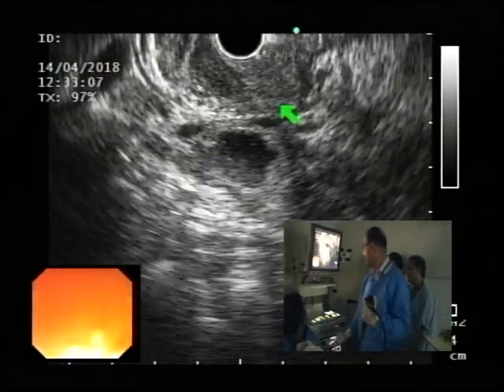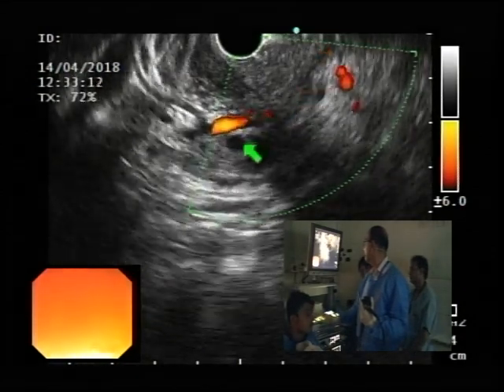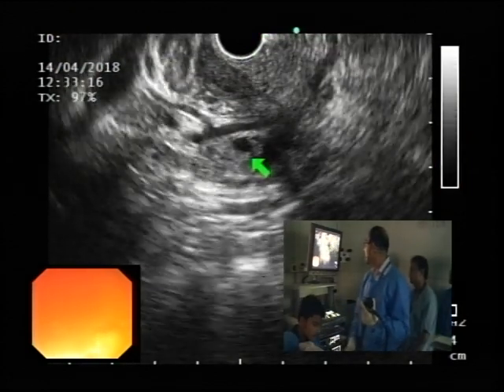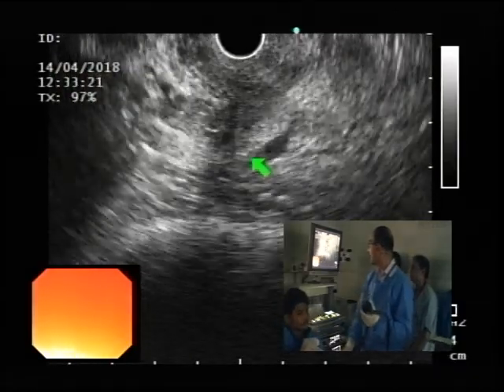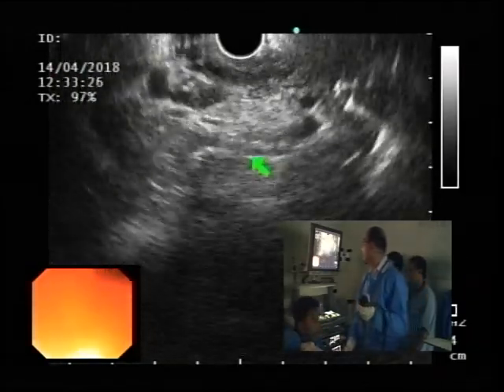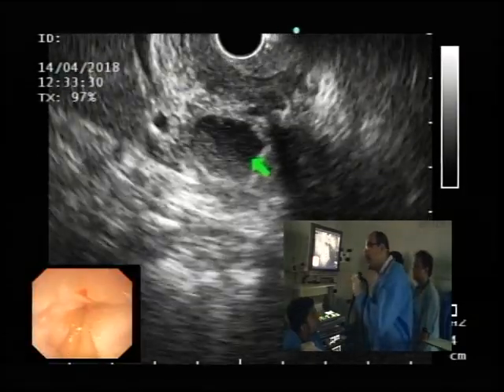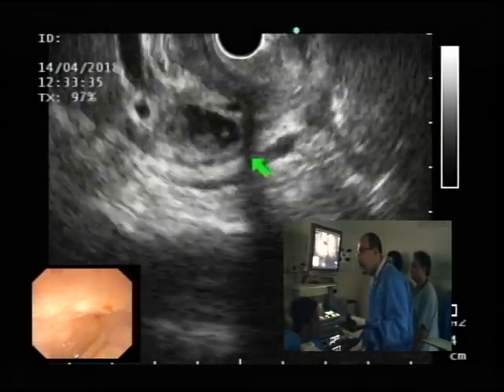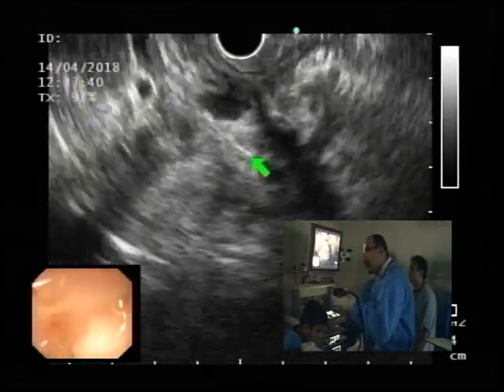So we have, I believe, come upon the pancreatic duct here. This one here going down, because that was the dilated duct. So now if I keep that in view and go counter, then I might be able to find the bile duct. In him, I'm not confidently being able to see the bile duct, so I'm going to move on now. I may have had it in view and not recognized it, but either way, it doesn't change the fact that I haven't seen it. So now I have to maneuver myself around the duodenal bulb.